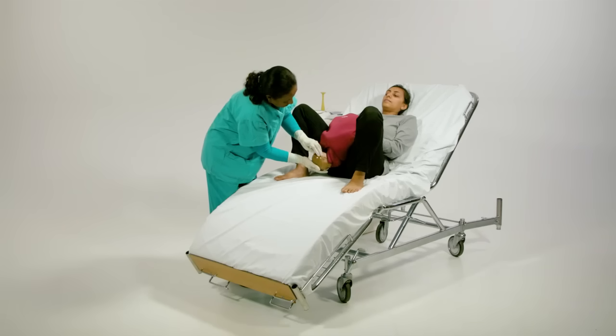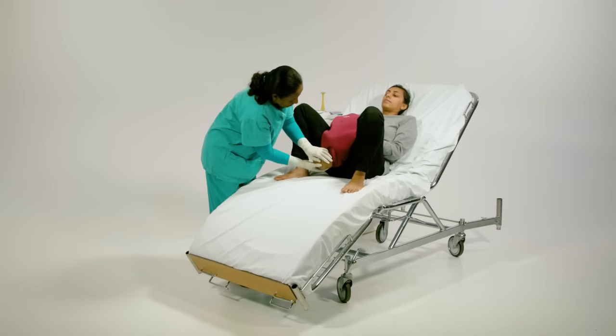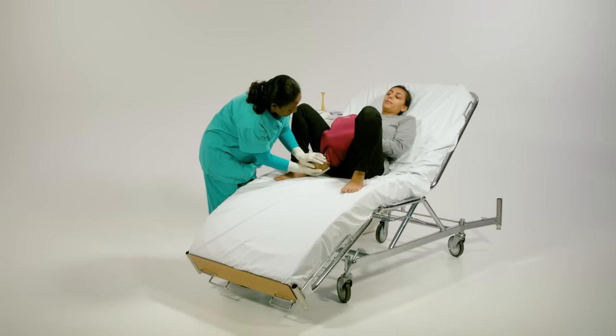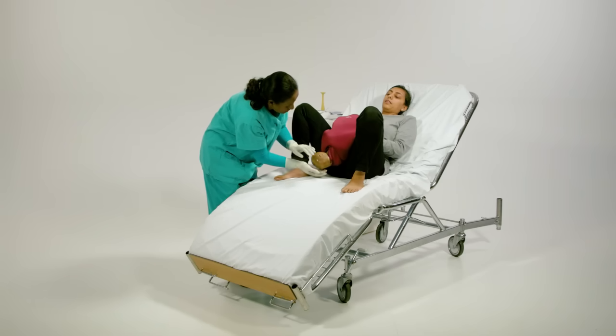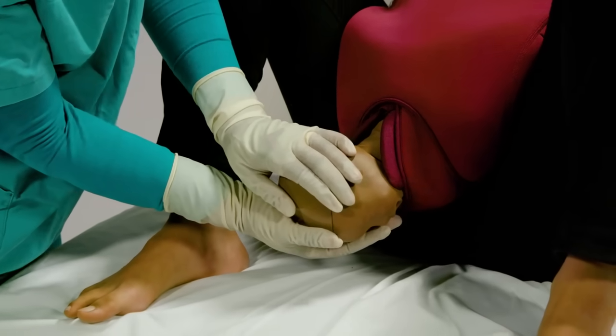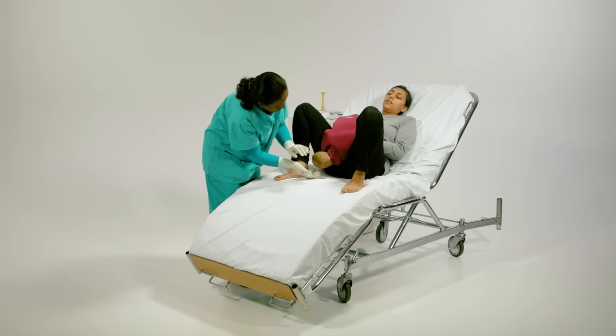The facilitator does not allow baby Berthi to deliver and pulls the body back in slightly to demonstrate the turtle sign. Despite the contraction and pushing effort, the shoulder is not delivered. Try to deliver the shoulder.